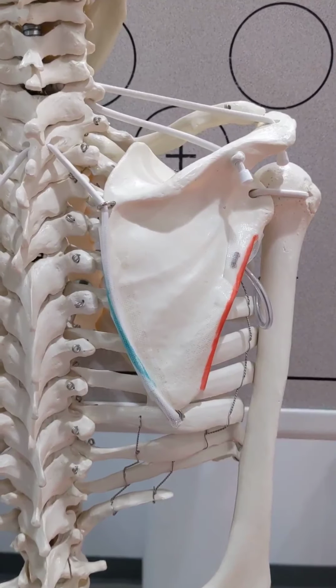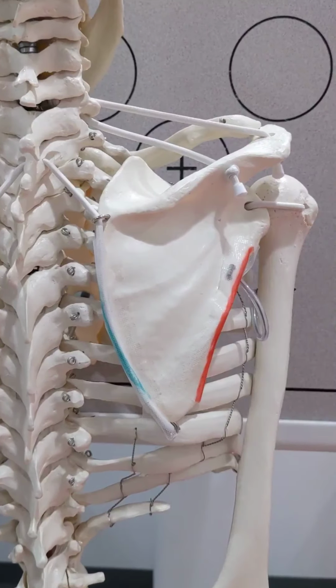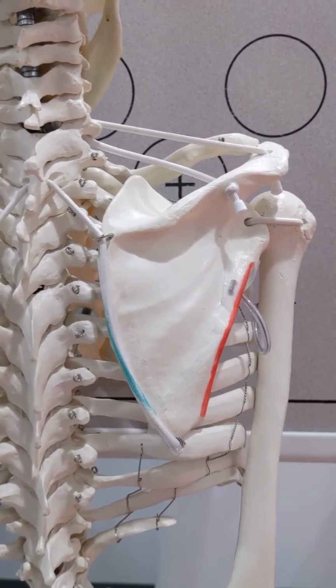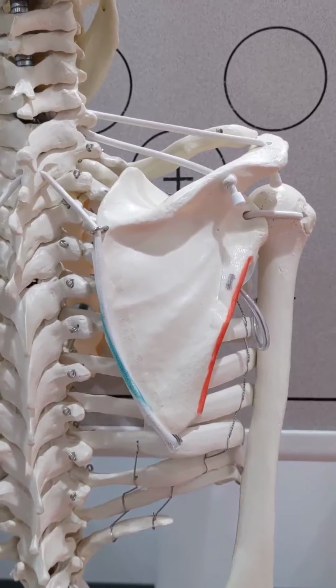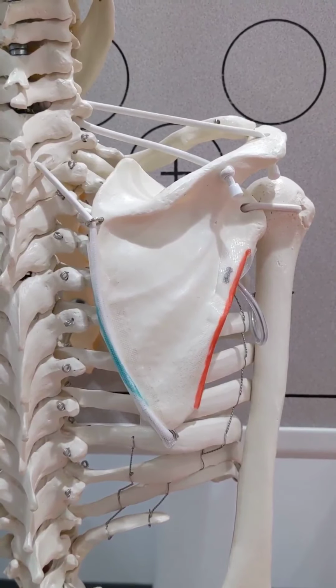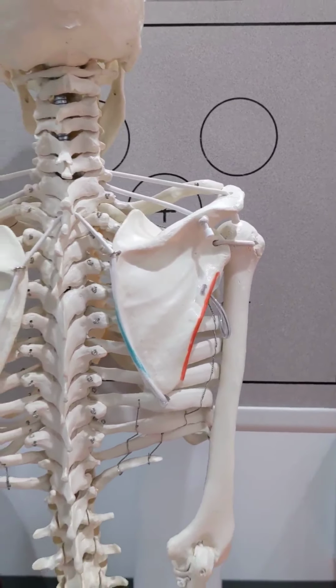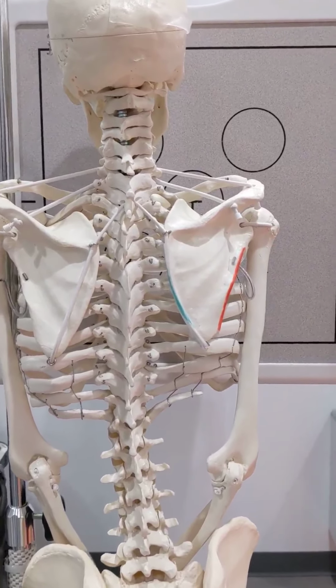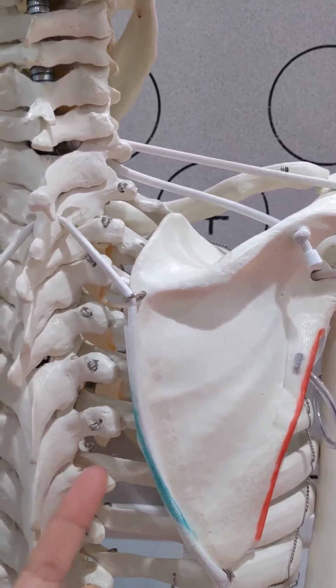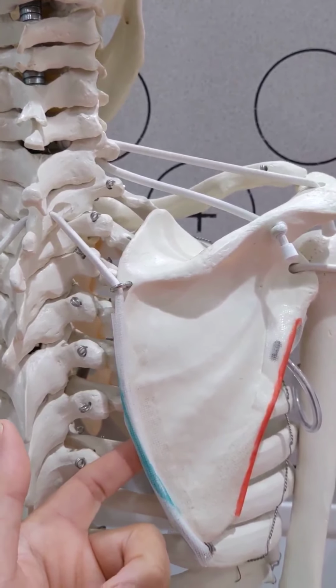So the transcapular Y view is essentially a lateral projection of the shoulder joint or the shoulder girdle. So what we're trying to do for this projection is actually bring the scapula into a lateral position. So in this position, what we can see with the patient from the back is that we can see the posterior aspect of the scapula, and the anterior aspect is of course on the other side.